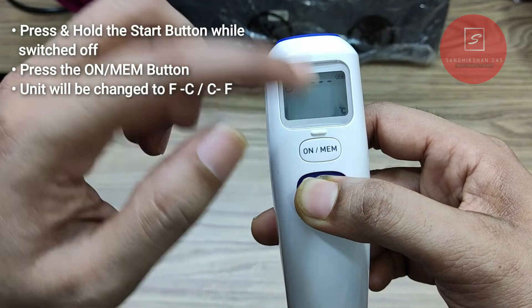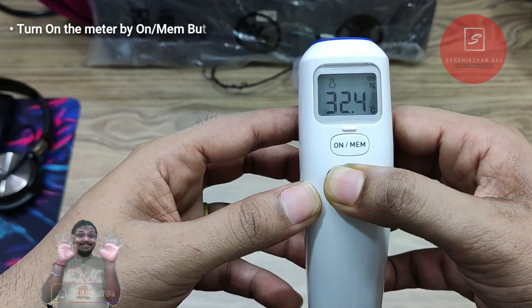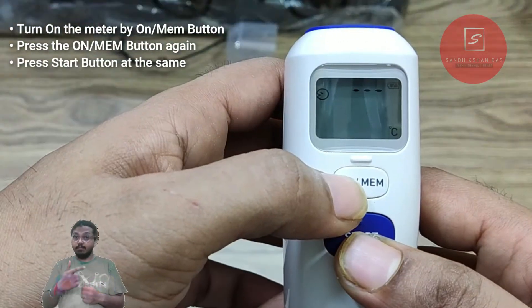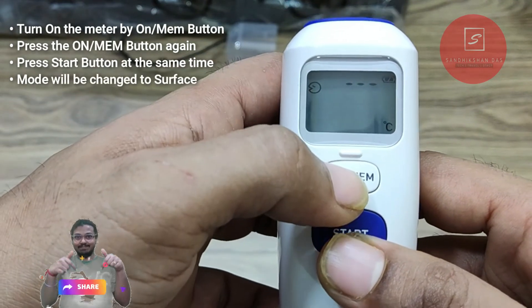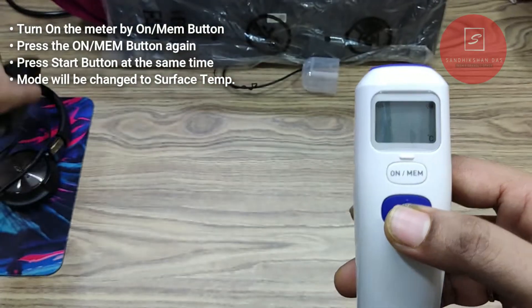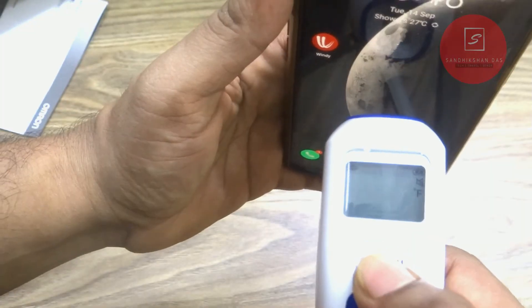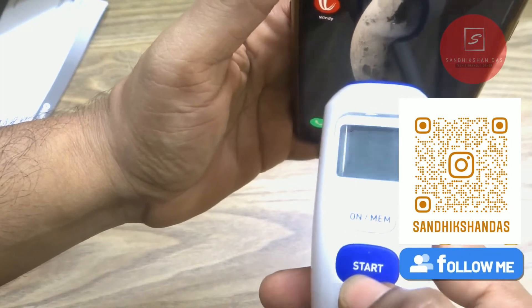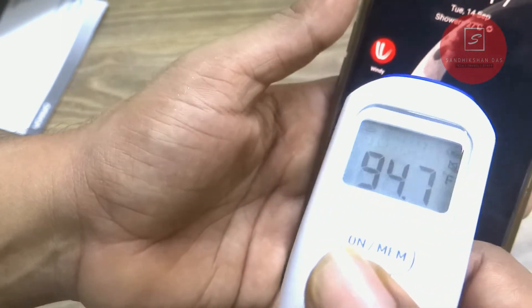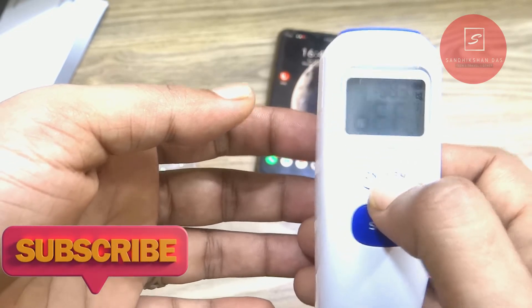Note that all stored memory will be cleared when you change the unit. To measure surface temperature, change the mode from human to surface temperature by turning on the meter, then pressing and holding the on/MEM button while pressing the start button at the same time. The surface temperature sign — like a Wi-Fi icon — appears on the left-hand side of the display. Do the same to go back to human skin mode. Move the meter towards the surface you want to measure and press the start button. It will give the surface temperature within 2 seconds. If the surface is too hot, hold the meter 3 to 5 cm away from the surface.